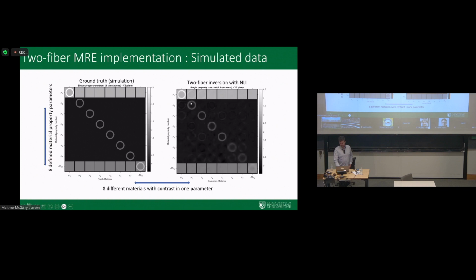So we do a really good job for the first 5. There is a little bit of crosstalk. You can barely see that on that screen, but the interaction moduli are pretty difficult to calculate, so we ended up just lumping those into 1 parameter. But this shows that we can do reasonably well in a very idealized case.